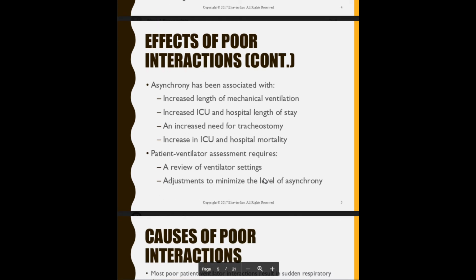So asynchrony has been associated with, again, we talked about increased length of mechanical ventilation. After a while, maybe the patient's feeling better, they might want to breathe on their own, but you got them on AC. And so they might start having a patient ventilator asynchronous event, and therefore you would have to deal with it.